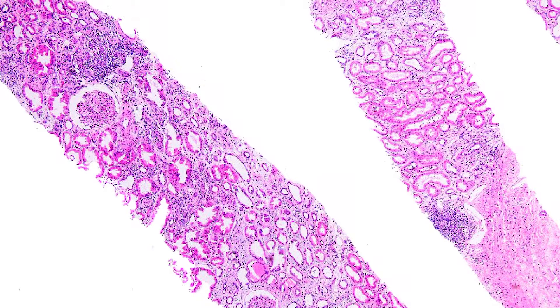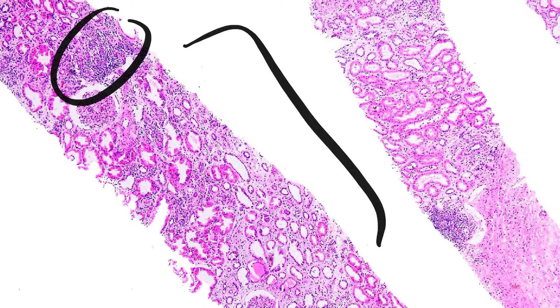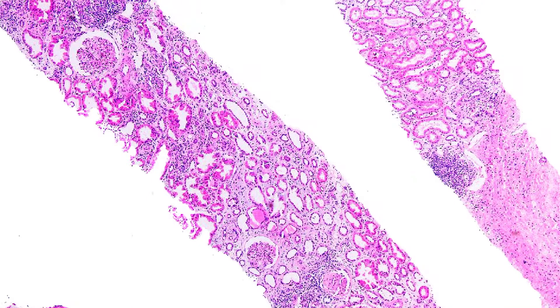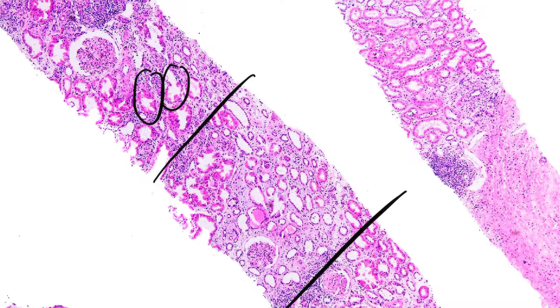As we look here at this low-power image, we can already see we have lots of blue throughout this piece of cortex, consistent with interstitial inflammation. Additionally, we have significant tubular injury that we can see as well, characterized by epithelial simplification in areas of ectasia. In the biopsy specifically through this area, we also see significant interstitial edema, all from this low-power view.